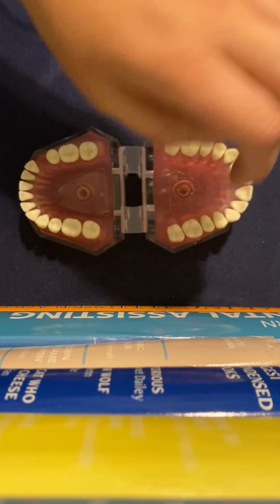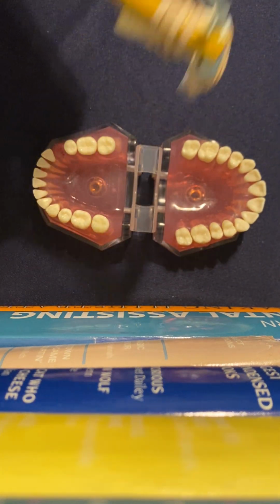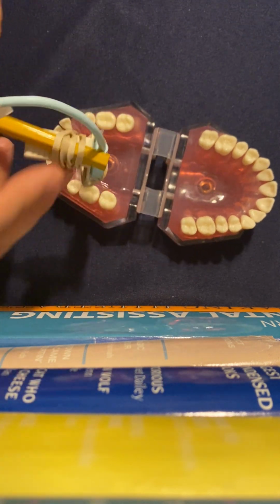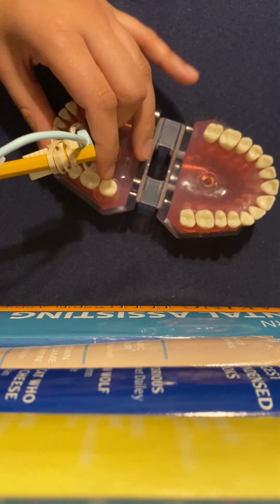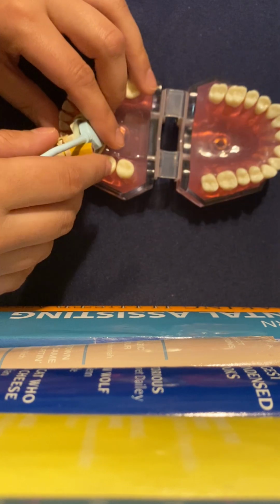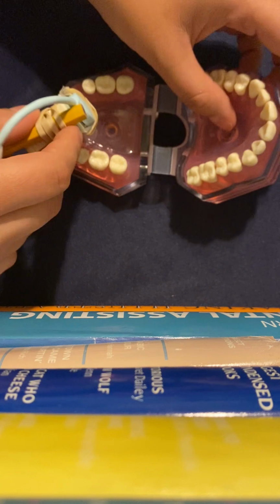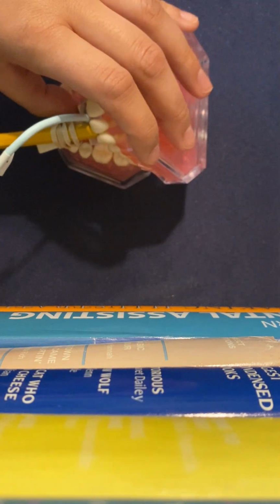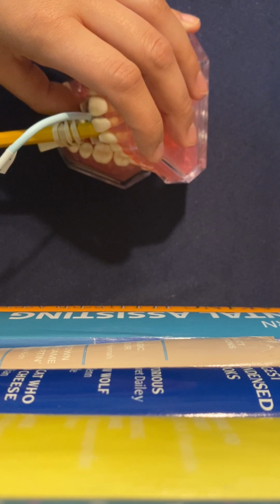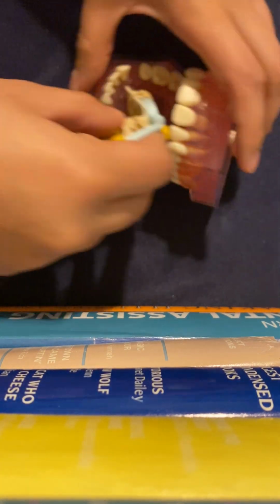Number 4, you're going to want to do the mandibular left canine lateral incisor. I almost did the right side. That was bad. Because I'm going to do the left canine. So his canine's right there. So you're going to want to center it with the lateral canine contact point. And the teeth you're going to want to see are the distal of the lateral incisor and the mesial and the canine apices. So I'm going to have to pick this one up.